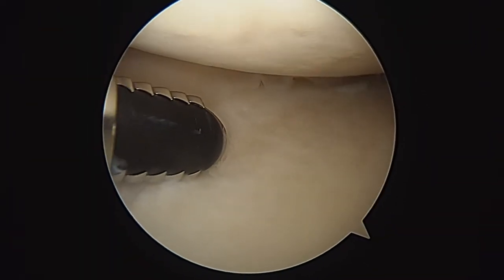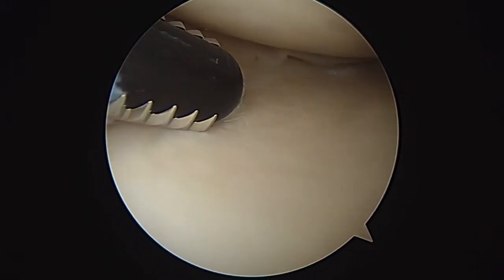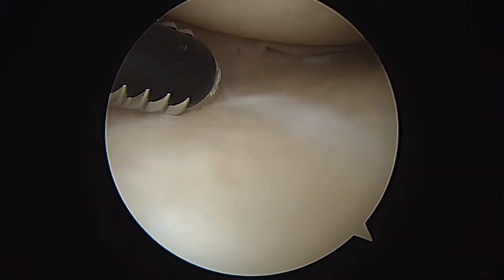Hi, it's Dr. Buford. We're just getting started on the left knee. We've already harvested the bone marrow and made a nice bone marrow concentrate injection.